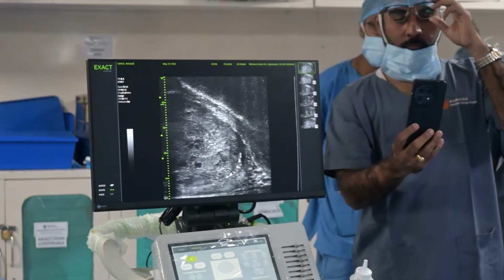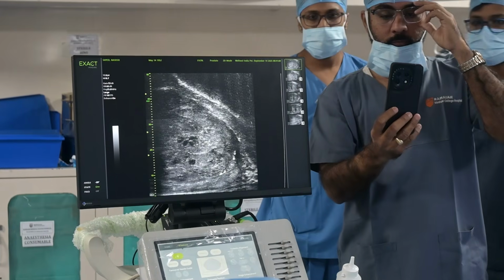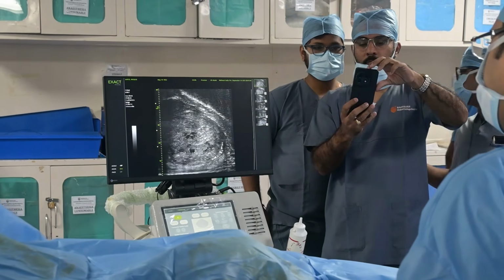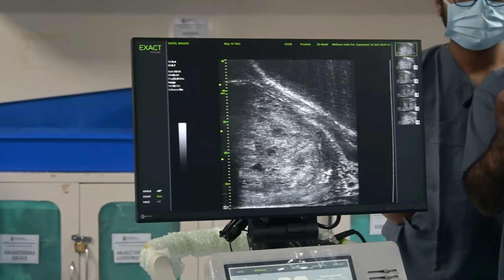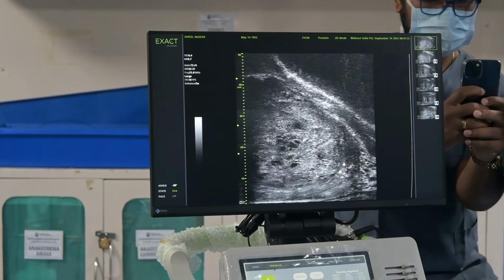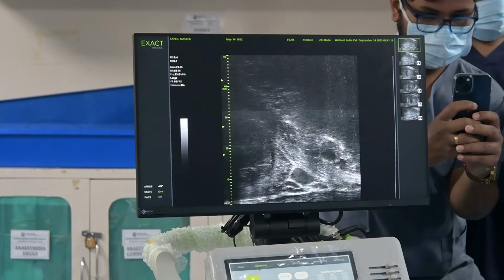Okay, so sir, this is my probe, and I'll show you the probe once I'm done with the procedure. So the only natural array that you get in a micro-ultrasound is the sagittal view. At this point I have a 50 mm view, and during the course of the lecture I'll tell you the details and significance of what views, how to do it. But at present it is a 50 mm view that covers the whole prostate.